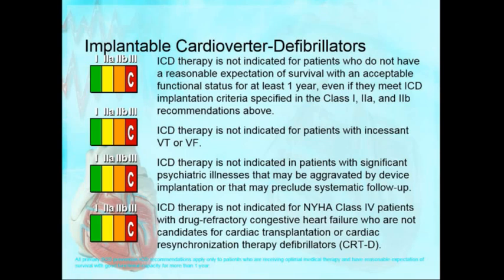They will never ask you an indication for a BIV pacemaker. If you're going to maximize your effort to read, look at the indications for ICD and BIV ICD. Pacemaker, you will guess it. They will never ask you about a BIV pacemaker.